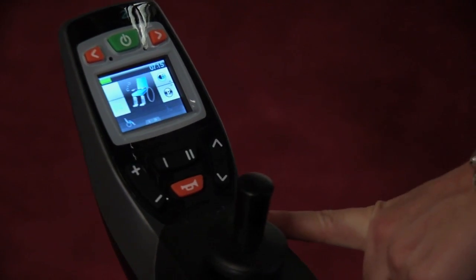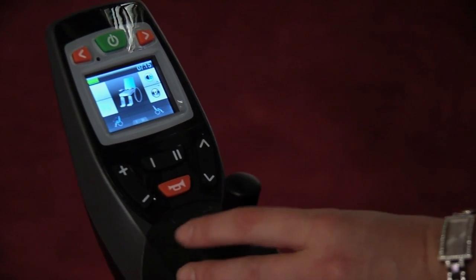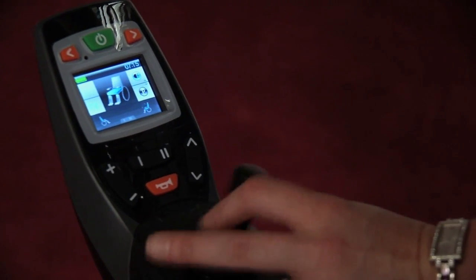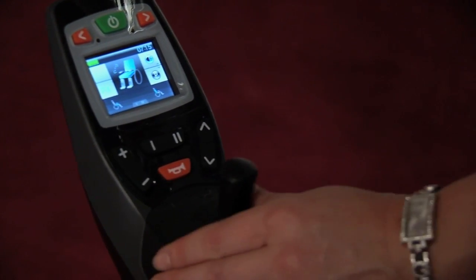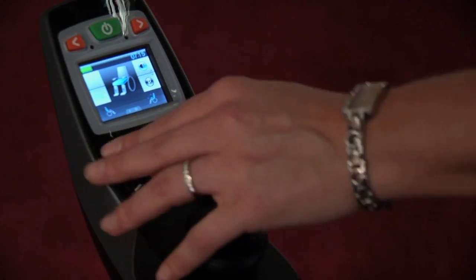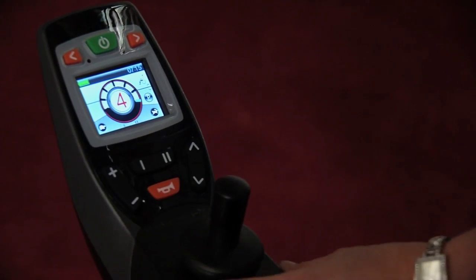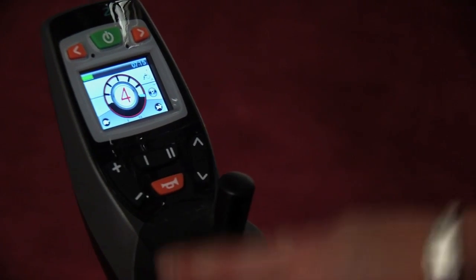This is to help you scroll through the power options. This is our tilt and space, our power recline, and our seat elevator. And you just go to one and just hit either way. And it's the same with driving. Of course, it drives like a standard mid-wheel drive, so you can turn in its own radius by either going left or right. Forward or reverse, of course, will take you forward or reverse.